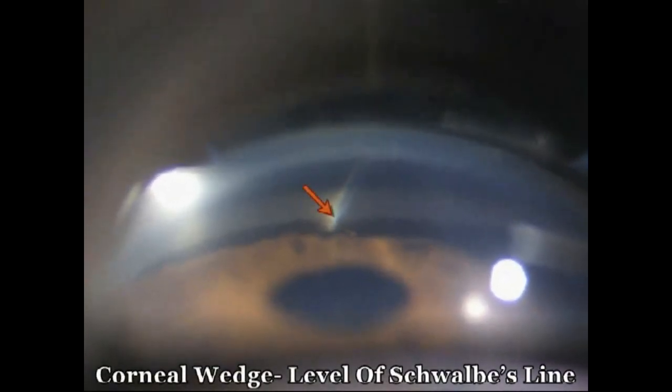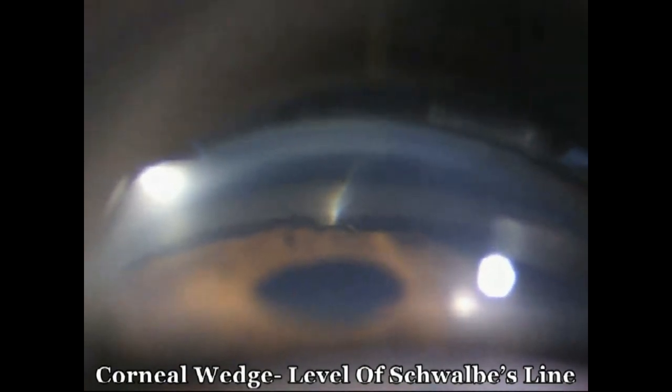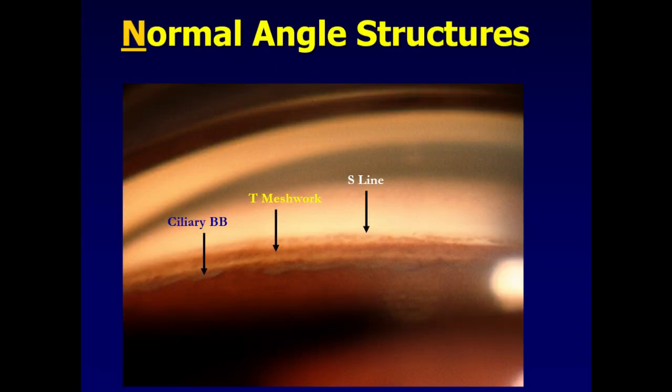We do that using the corneal wedge technique, where a thin slit beam is projected, the tip of which indicates the level of the Schwalbe line, following which we identify the normal angle structures from the Schwalbe line up to the ciliary body band.